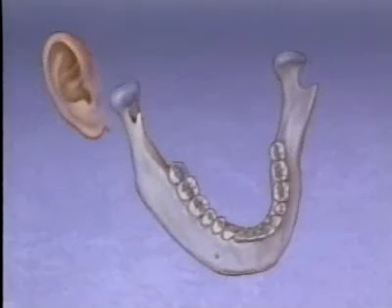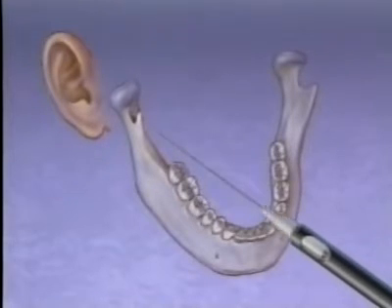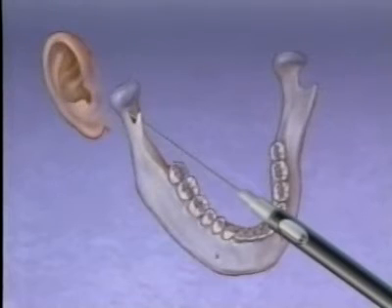The needle is advanced in this plane just medial to the deep tendon of the temporalis muscle and through loose fatty connective tissue until it strikes the lateral neck of the condyle. Perhaps the most challenging aspect of this injection is determining the proper angulation of the syringe within the plane of insertion. According to Gow-Gates, the lateral flare of the tragus parallels the proper orientation of the syringe.